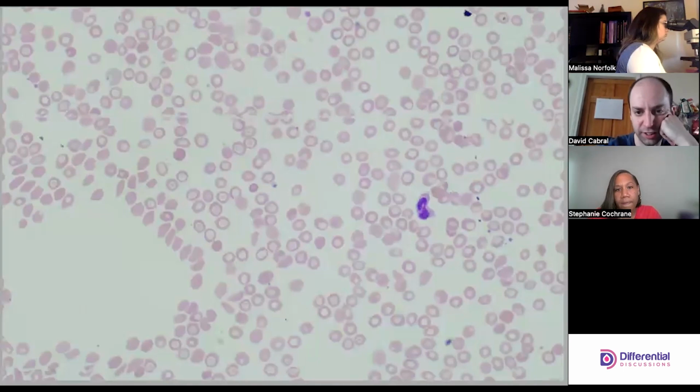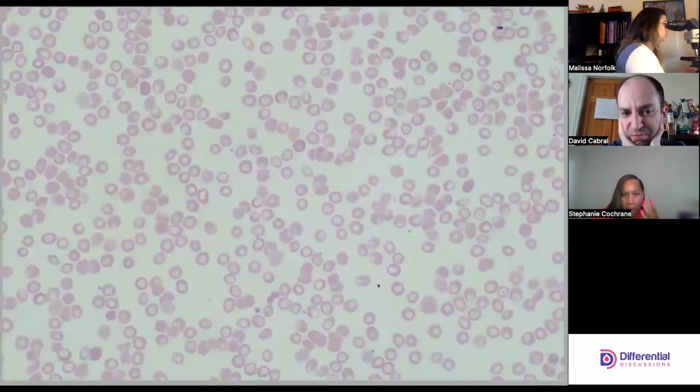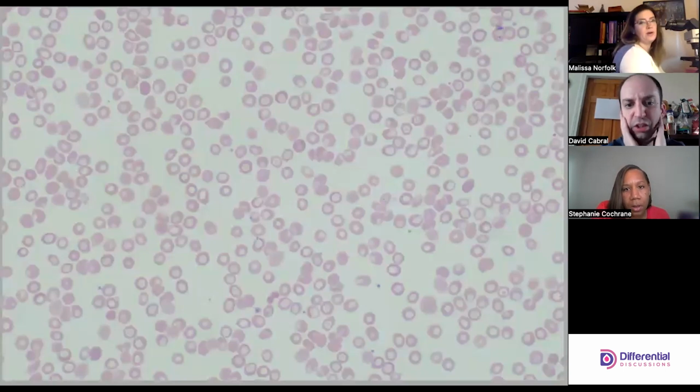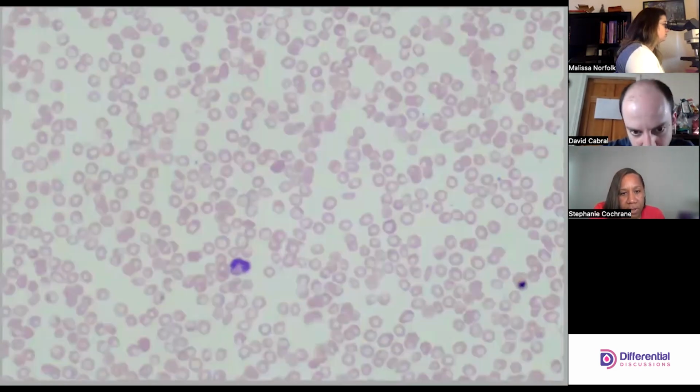Okay. I'm paying attention to the central pallor of the cells. Me too. That is not weird to me, but the MCHC I thought was normal. Yep. So it could be artifact, right? It's possible. Are those target cells too? Looks like a 1 or 2. It just looks like the refractory rings. Okay, so that might be artifact. We'll see it better when we go down. So we'll try to trust the MCHC and that it's normal. But it's a little bit thicker. Is that a band? Yeah, looks like it.